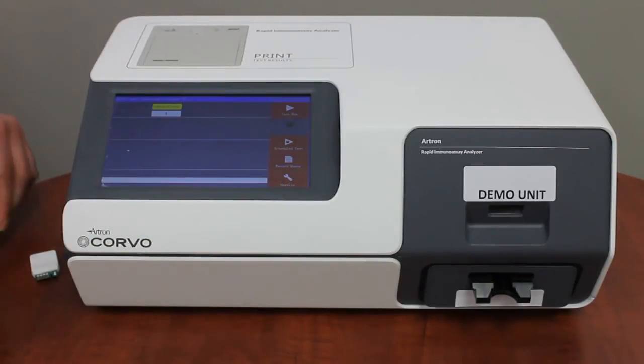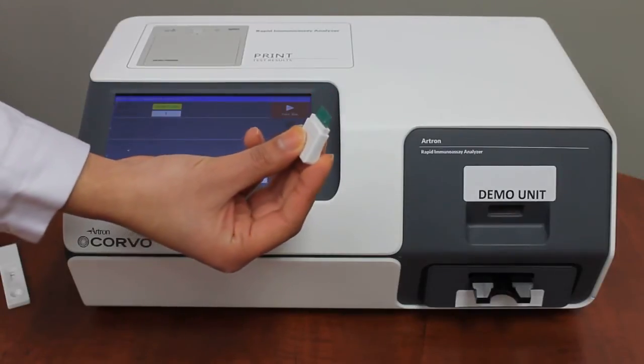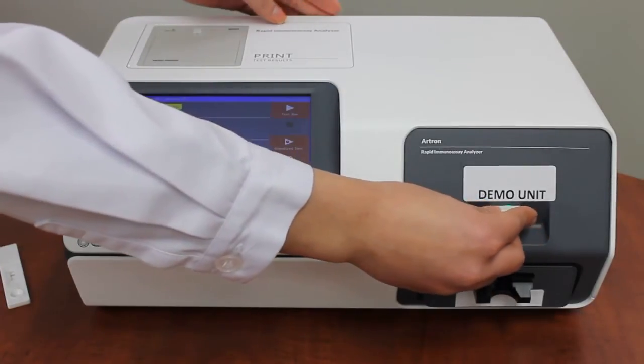Lot keys with specific calibration data are provided for every order of RTRON cassettes. When quantifying cassette results, make sure the corresponding lot key is first inserted into the ID card slot.